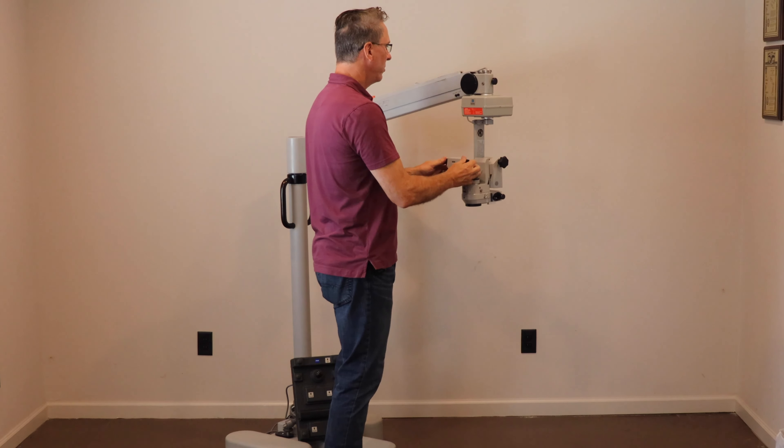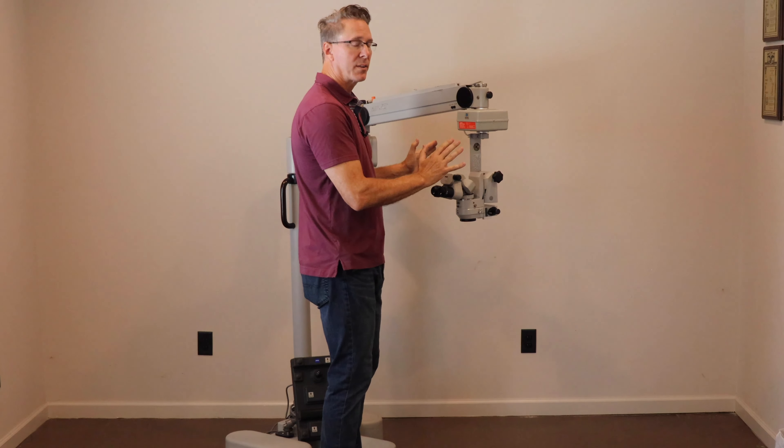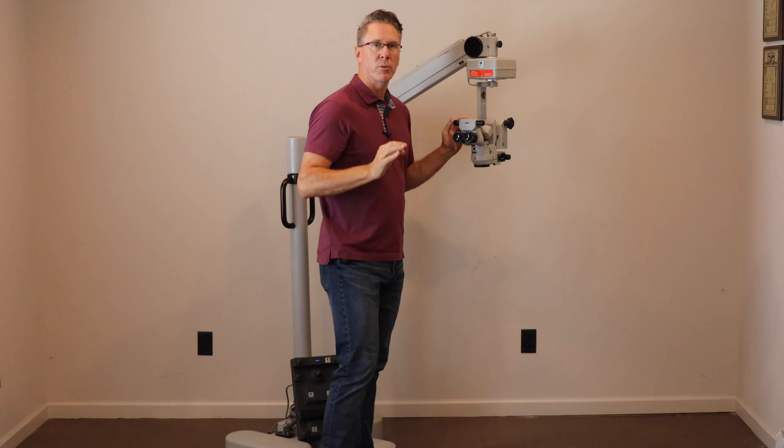The movement of the arm is excellent — you can put it wherever you want it and it's going to stay right there. So let's talk about modern illumination.